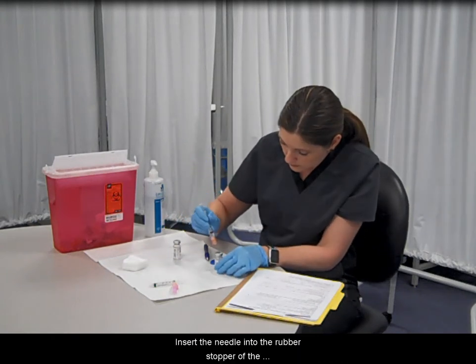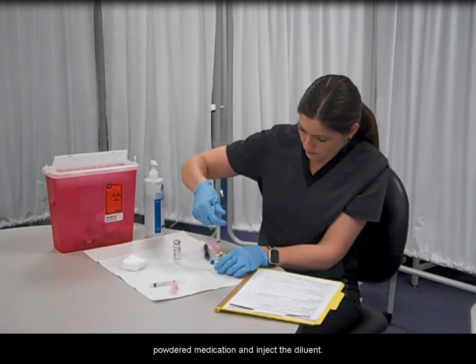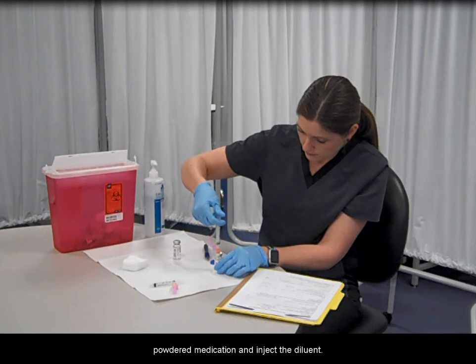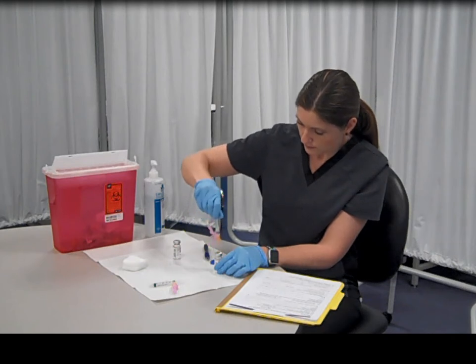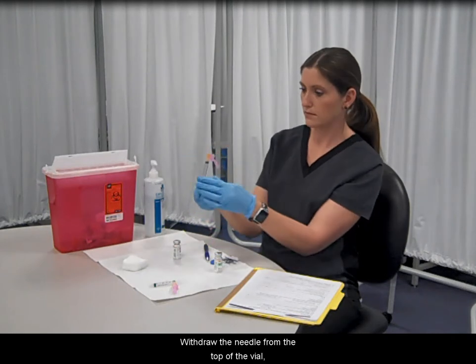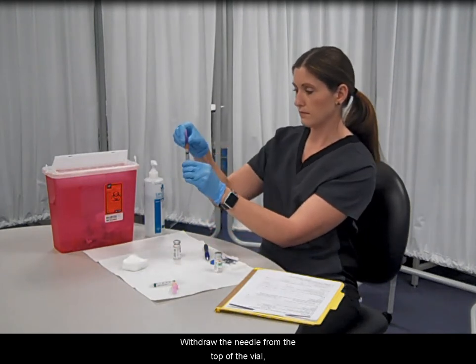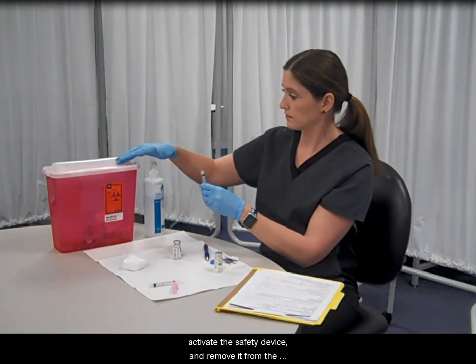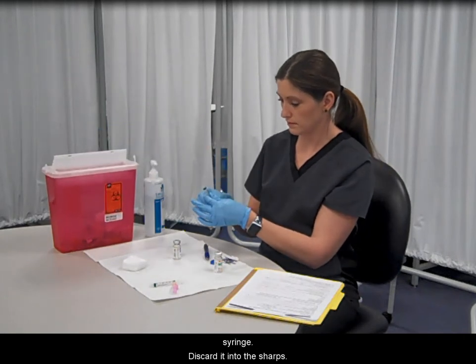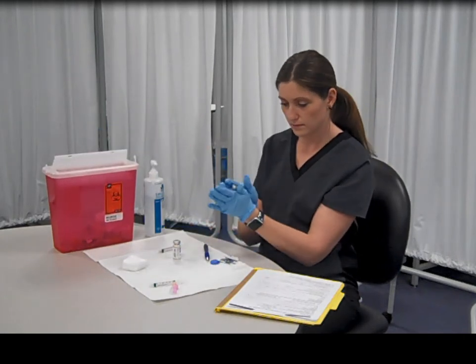Insert the needle into the rubber stopper of the powdered medication and inject the diluent. Withdraw the needle from the top of the vial, activate the safety device and remove it from the syringe. Discard it into the sharps.